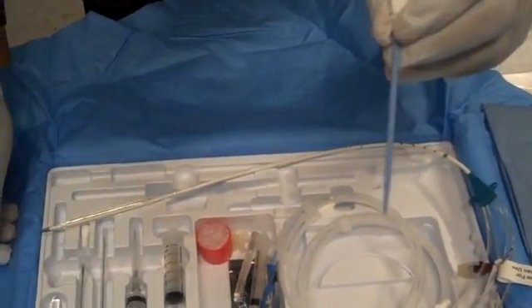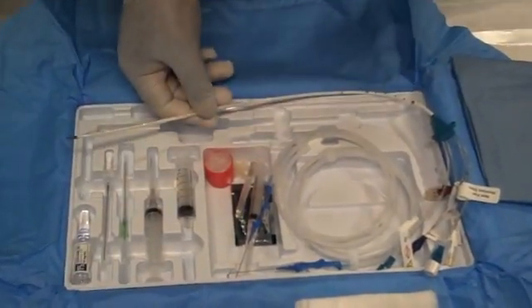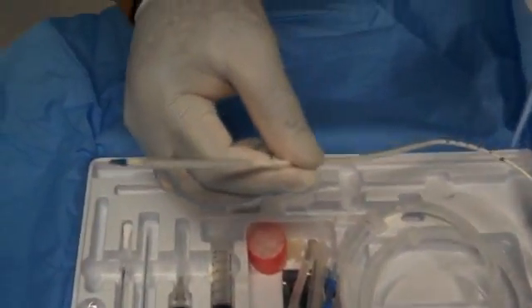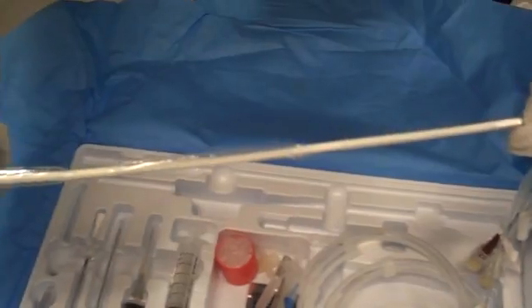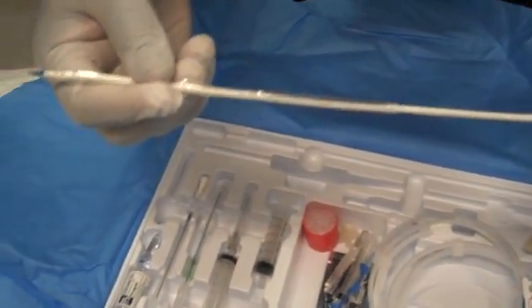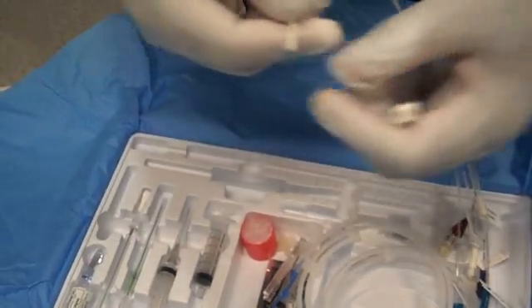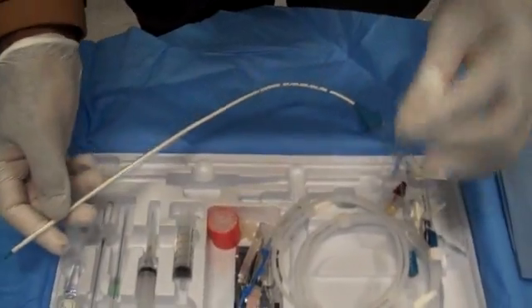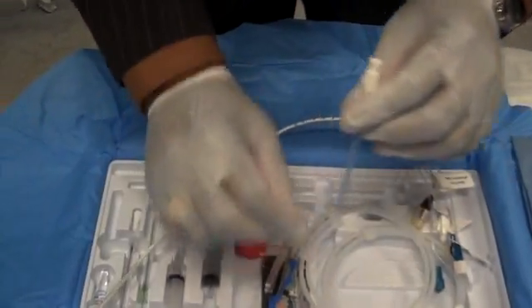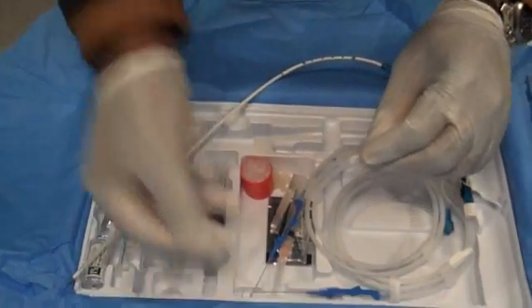You want to be fairly aggressive with your dilation — you're going from the guide wire to basically a 9.3 French catheter. When the catheter comes out, it will have a protective cover over it. Keep that protective cover on right before you thread the triple lumen over the guide wire. After dilation, leave the wire in, hold onto the guide wire, and remove your dilator.